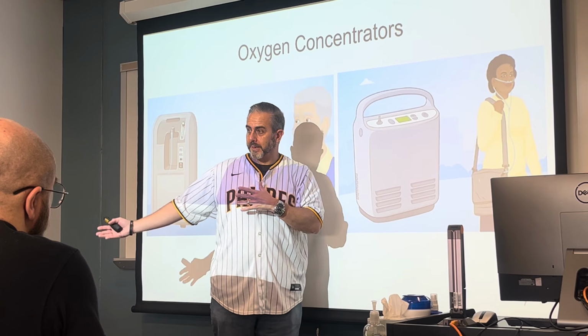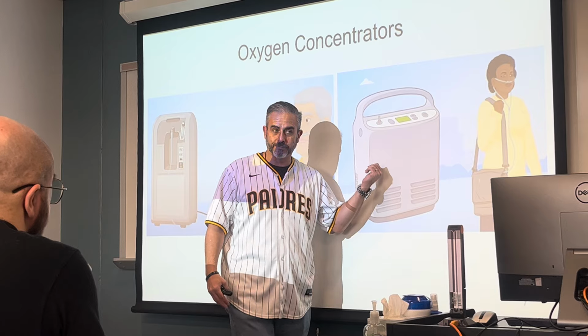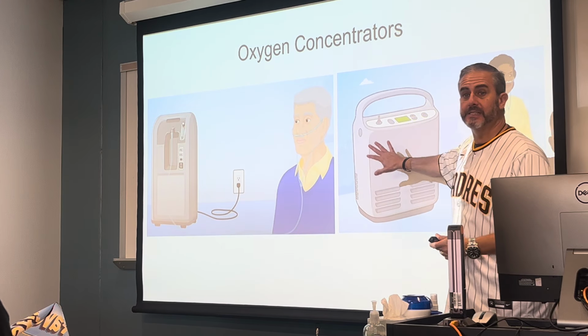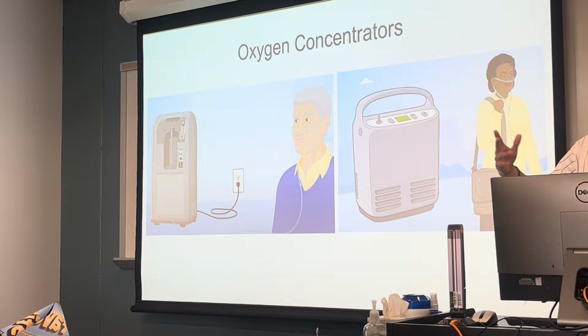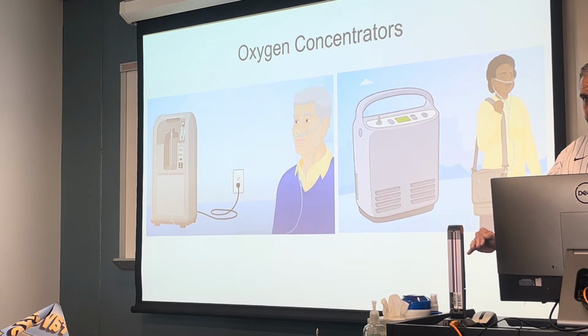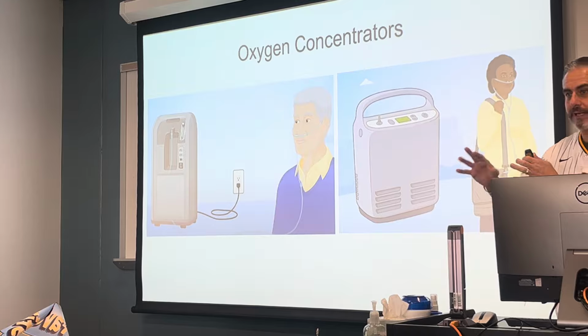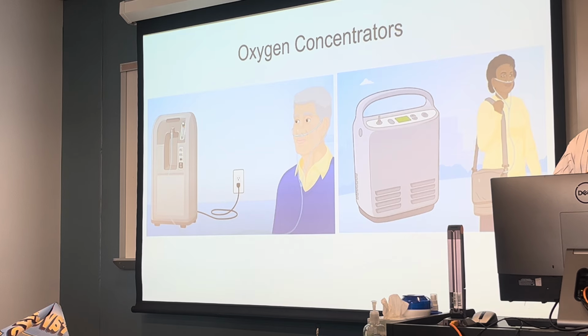You can come back, switch those batteries, recharge the second one while you plug the fully charged battery into this. And so this is a nice, simple, easy way for the patient to always have oxygen, as opposed to a tank that once it's empty, it's empty. They're gonna have to have somebody come in, take that tank, refill it, and bring it back, or switch out tanks, take your empties and give you some full ones, and that can take time.